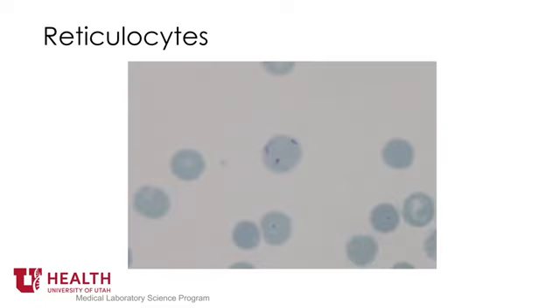Manual reticulocyte count. Reticulocytes are non-nucleated red blood cells which contain ribosomes and mitochondria. A stain for either would distinguish them from mature red blood cells. Red blood cells in suspension are incubated with a supravital stain, which simultaneously denatures, aggregates, and stains ribosomes.